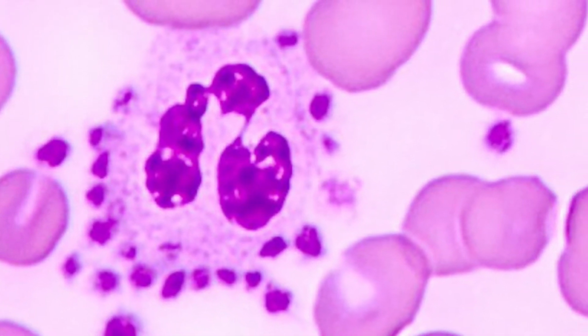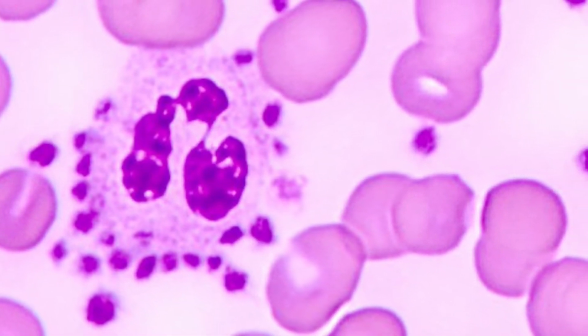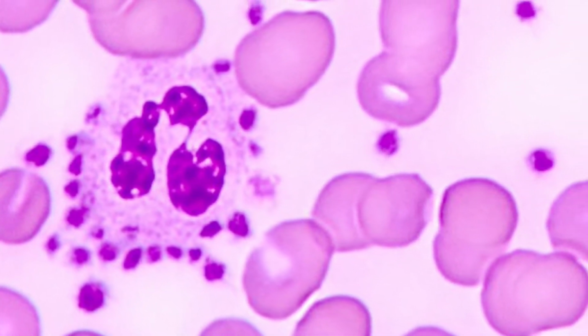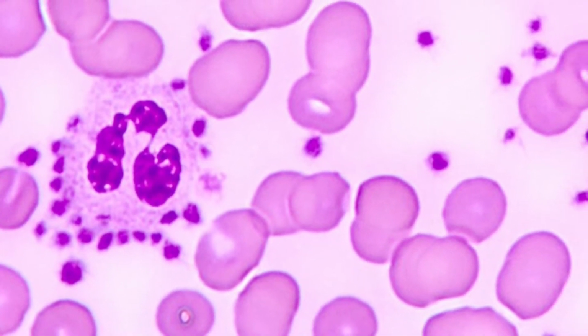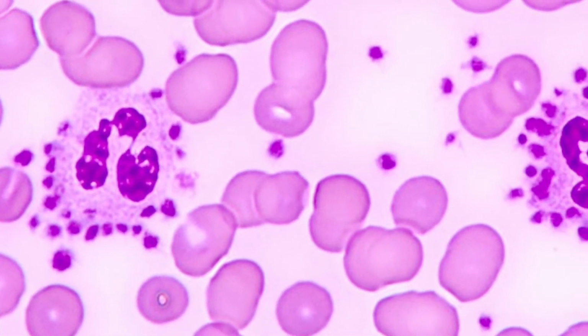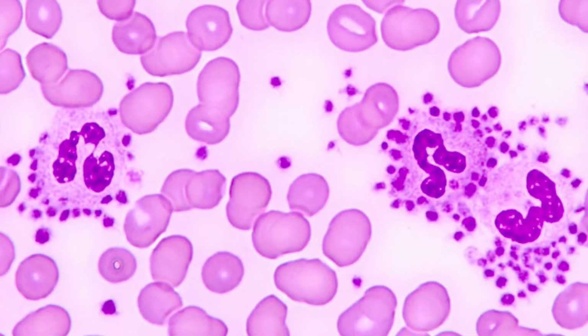Thrombocytopenia is having a low platelet count. Here, we will be focusing on pseudothrombocytopenia, aka PTCP. PTCP is an in vitro phenomenon of an artificially low platelet number and is identified only microscopically.